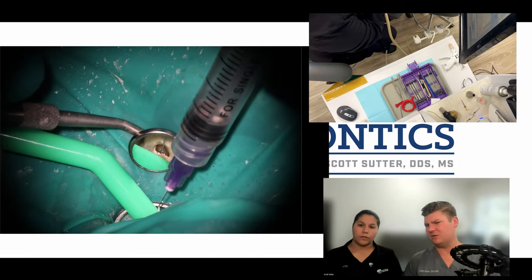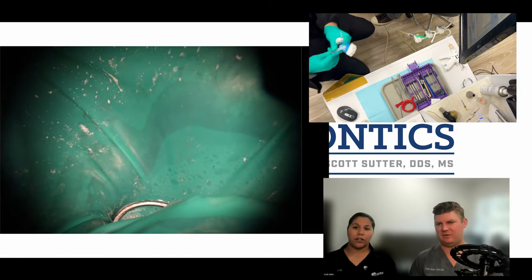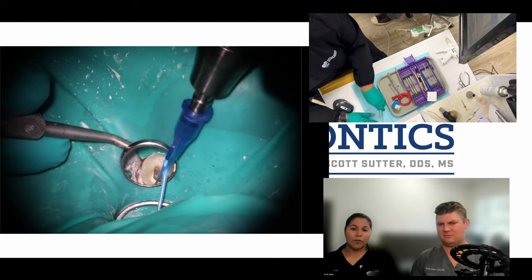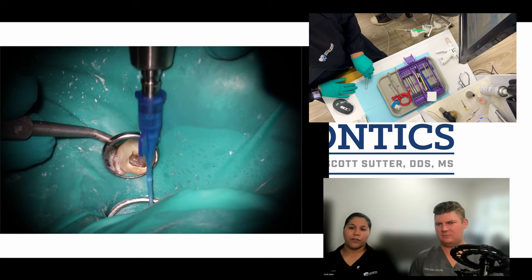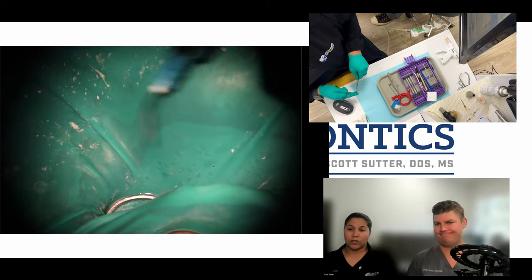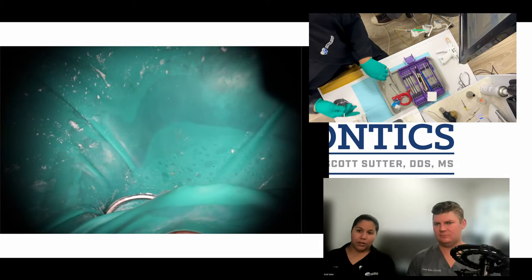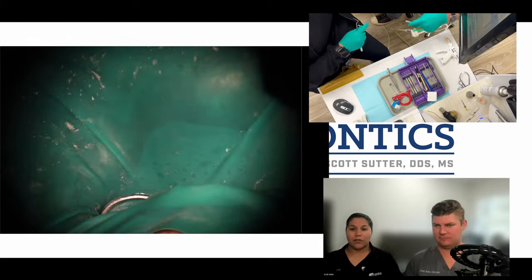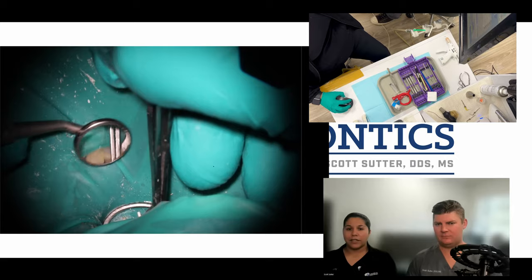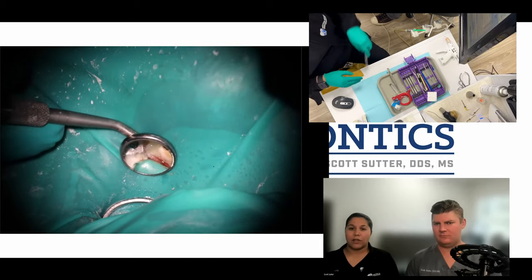A lot of times I don't put my suction down very much — it just saves time to hold it in my hand. That's more with single canals because it's so quick compared to a four-canal tooth. Doing that final rinse, getting that debris out of there. Paper points come when you're using the micro suction. I've set suction down, taken my tip off, and prepped paper points — always moving them forward because they start on the corner of my napkin pretty far up. I don't want to move them or hit them in the trash, so I pull them forward. Utilizing every free second is important.